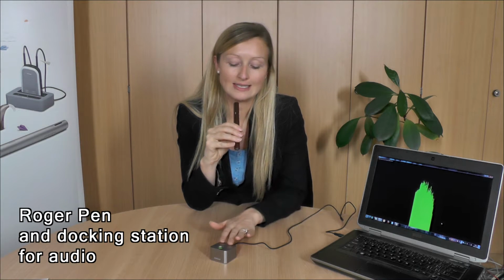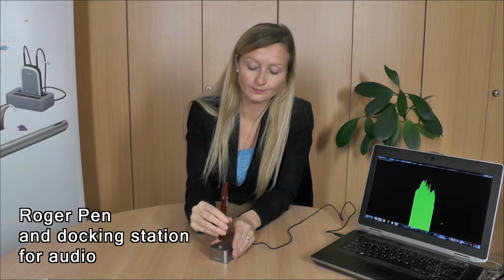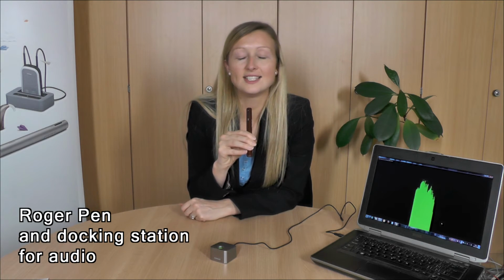So the Roger docking station is already plugged in to the laptop. All I'm going to do is put the Roger pen into the docking station, and straight away you should be able to hear the music. And as soon as I take it back out, the music stops.